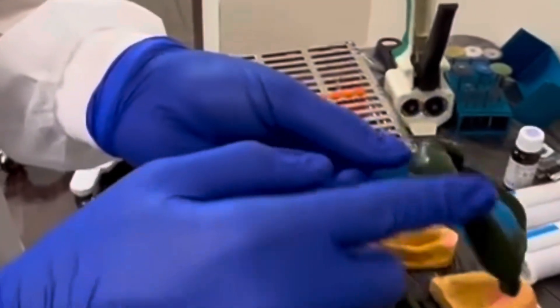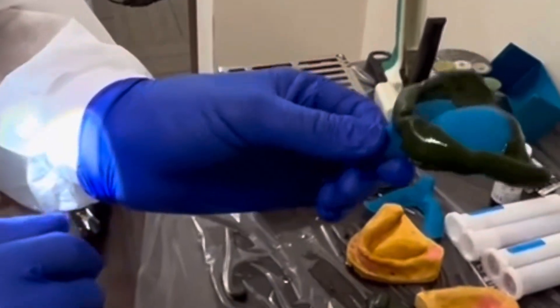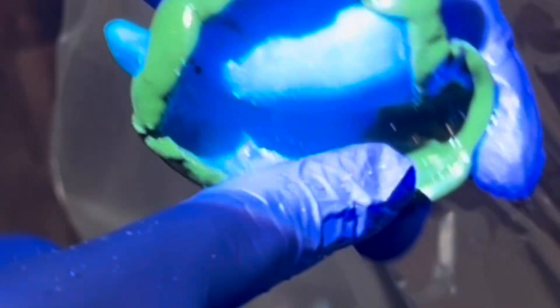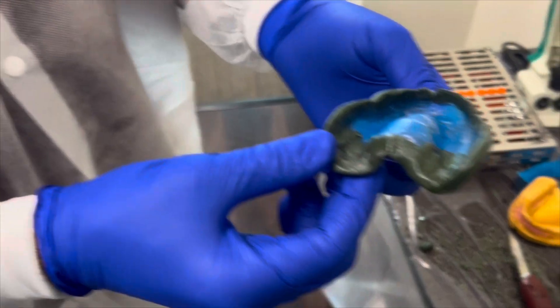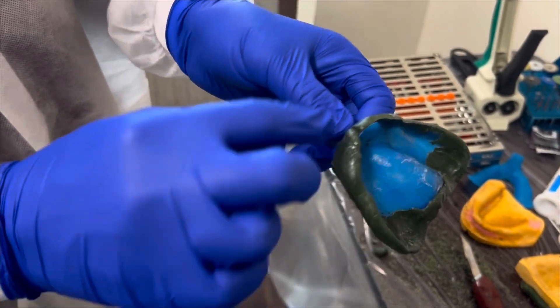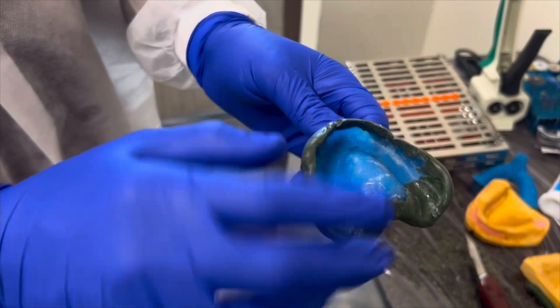Now the border molding is complete and we're ready to make the final impression, but before we do that we need to trim the inside of the green compound so that it is flush with the inside of the tray. This is done everywhere except the posterior palatal seal. We then apply adhesive to the tray and we are ready for the impression.